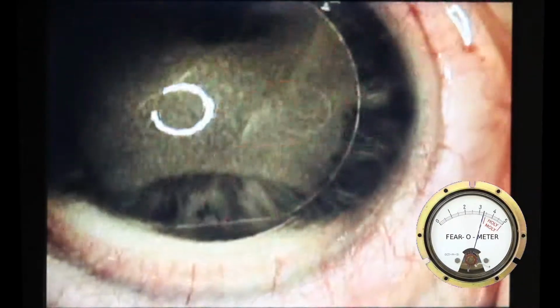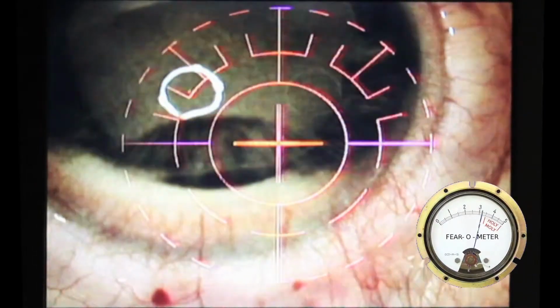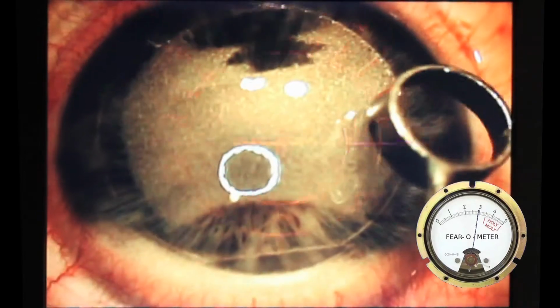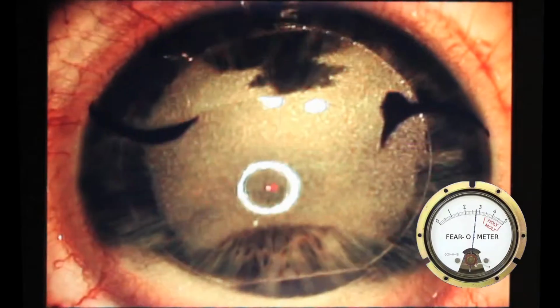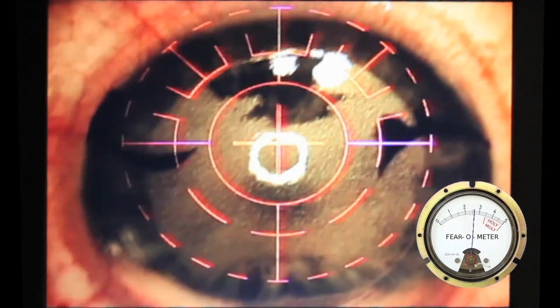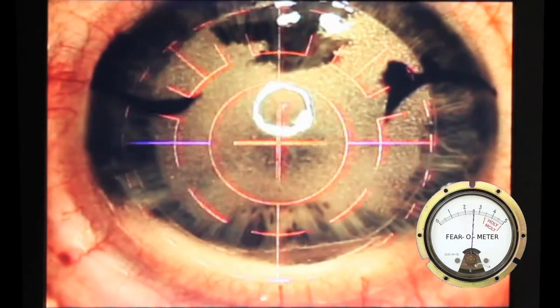Well, then they clamp your eye open, and then they mark the flap. At least I'm assuming that's what he does with this little die thing. He marks the flap on each side, and my assumption, being a carpenter and an engineer, is that this is just in case he accidentally tears the flap off. He knows how to put it back on. I don't know if that's true or not. I'm a layman, but it seems like that would make sense to me.